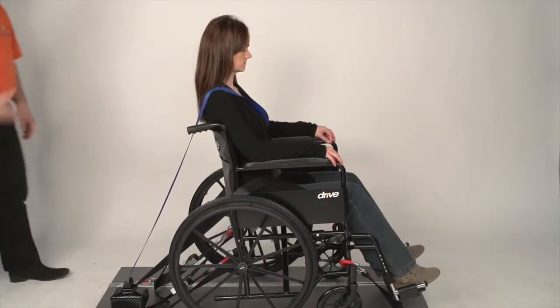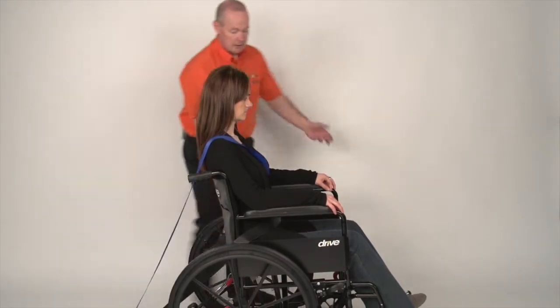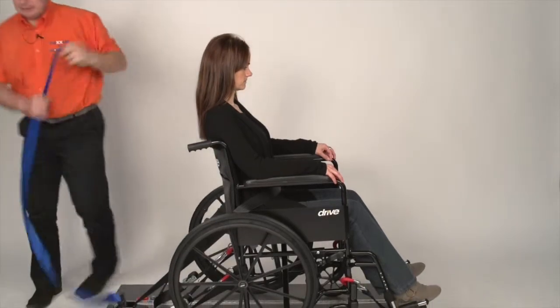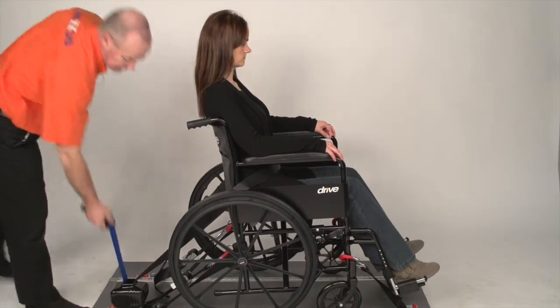To remove the system, start by removing the shoulder strap. Take hold of the blue strap, come underneath the armrest, back over the head and down. Remove the clunk clip and gently put it back into the reel.